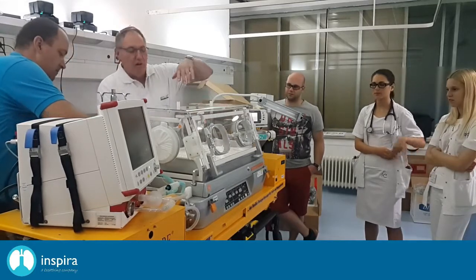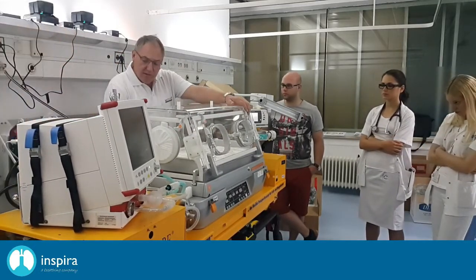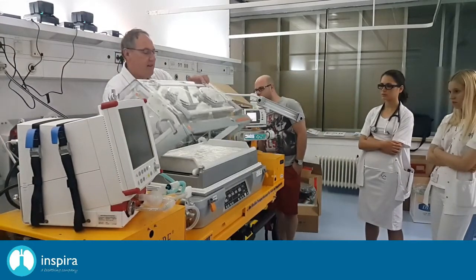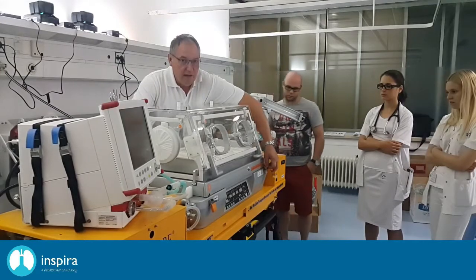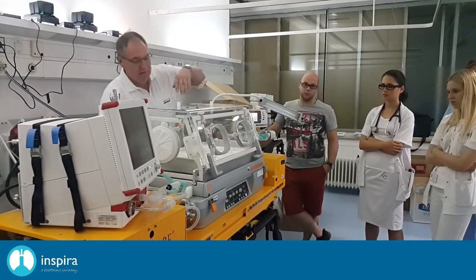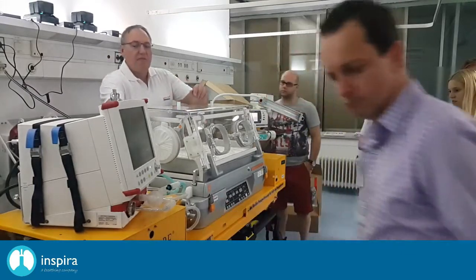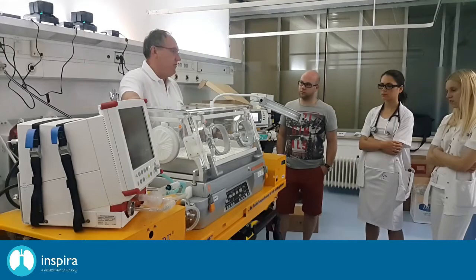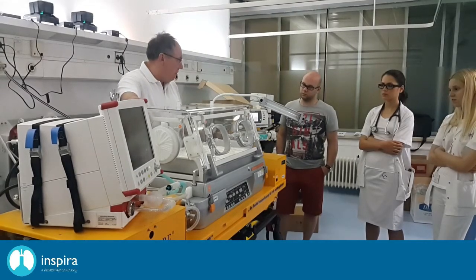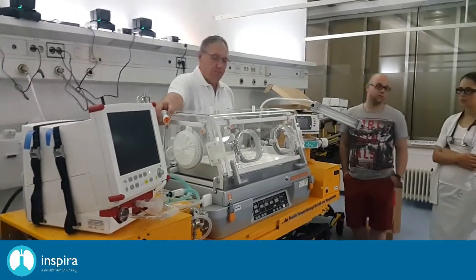Okay? So if you close the hood, just drop them down, and as soon as it's fixed here, try again if it's really fixed, and then close it again on the front side. Okay? On the back side of the incubator, you have an oxygen sensor. Okay? It's possible to insufflate the hood or the room of the incubator with oxygen.